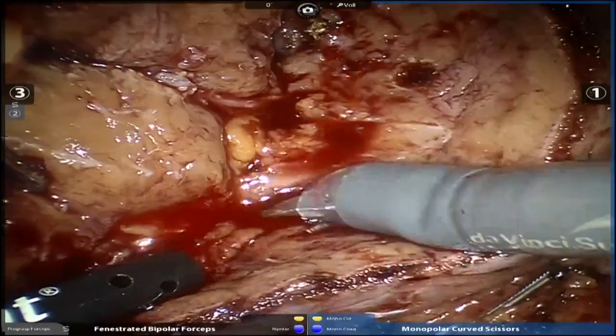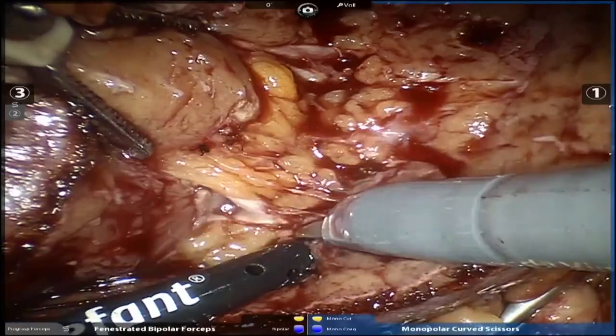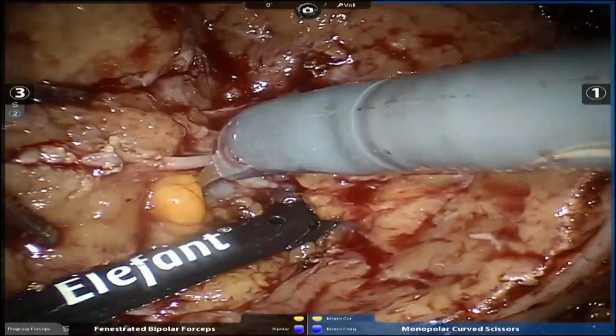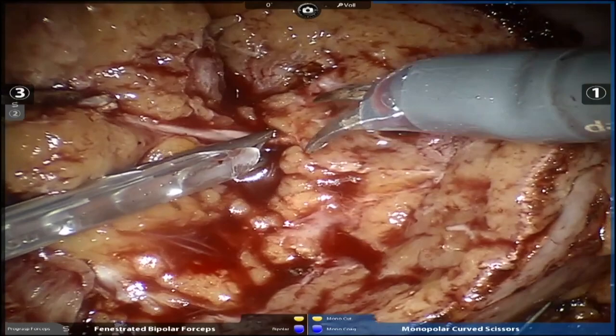Yeah, that's the fat of the hilum, isn't it? From the inside. Yep. There's fat. Collection system. Metal, 5 millimeter, Brando, 5 millimeter. That you will clip, don't you? Yeah. Good. If you can, Brando, if you can. If you can't, don't worry about it. Right here, if you can. Yep. Good. Let's go with that.